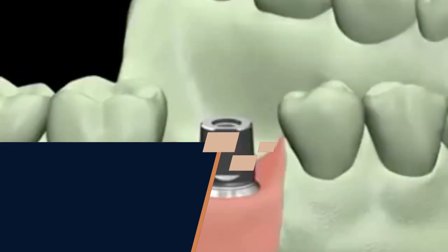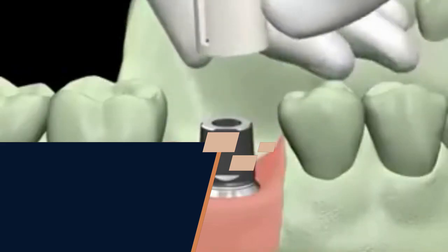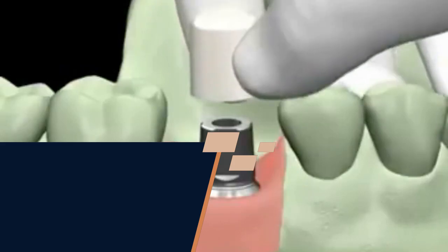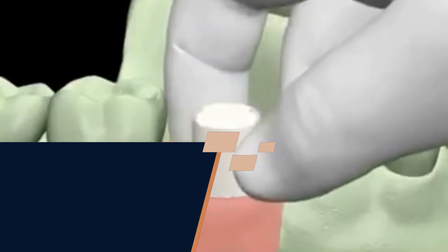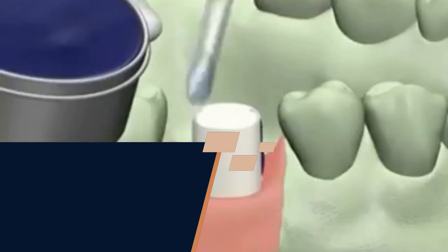Implant placement. The surgical procedure begins with the placement of the implant fixture into the jawbone. This is done under local anesthesia to ensure your comfort. The dentist or oral surgeon makes an incision in the gum tissue to expose the underlying bone, drills a small hole into the jawbone, and carefully inserts the implant fixture. The gum tissue is then stitched back in place, and the implant is left to heal.